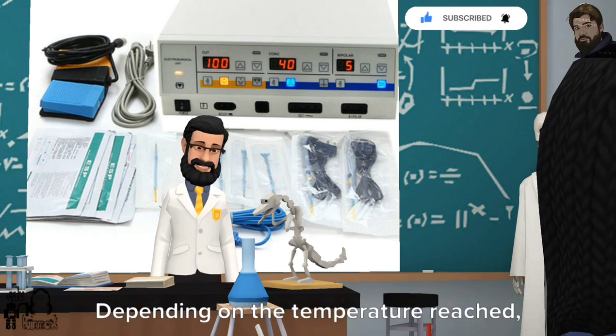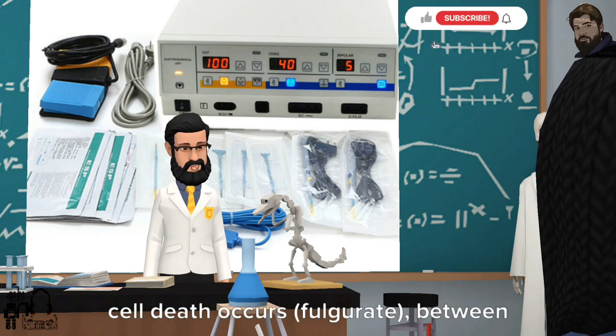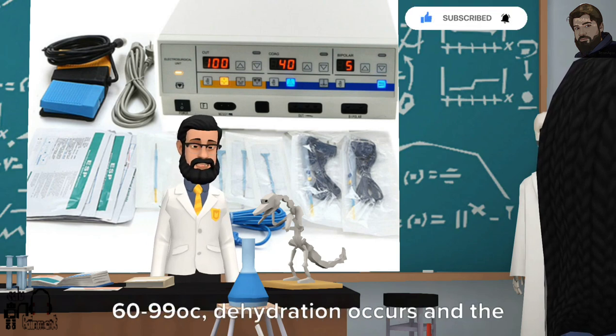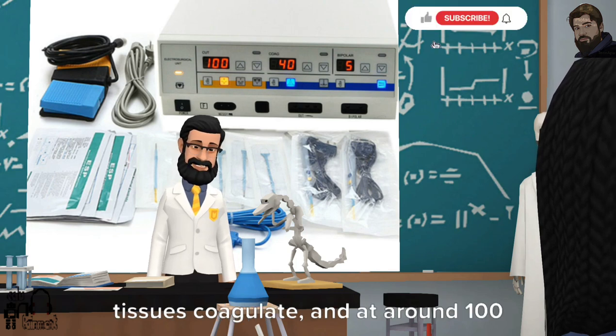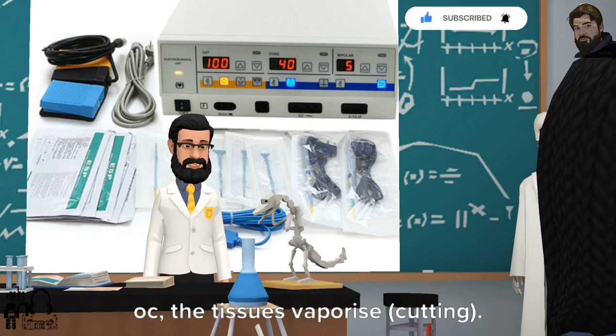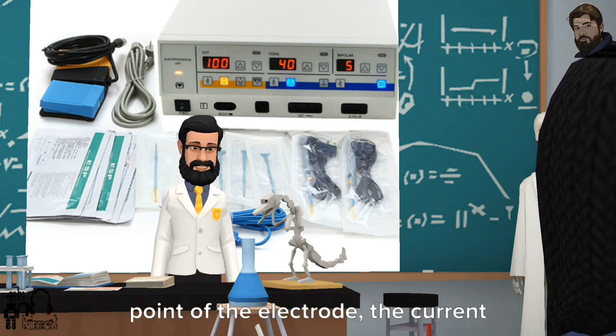Depending on the temperature reached, different results occur. At 60°C, cell death occurs (fulguration). Between 60-99°C, dehydration occurs in the tissues (coagulate). And at around 100°C, the tissues vaporize (cutting).